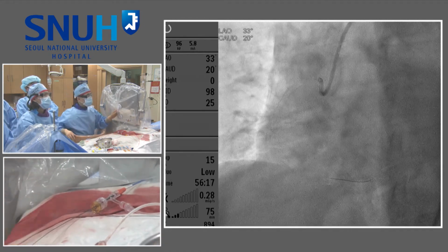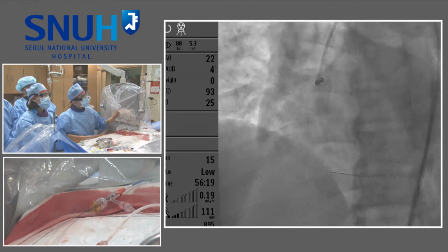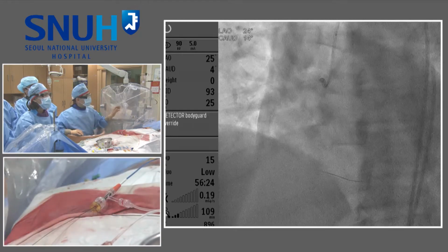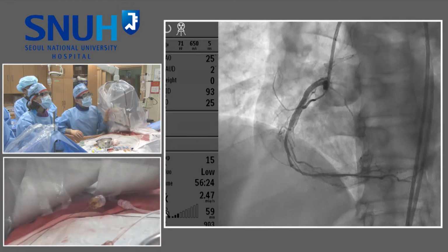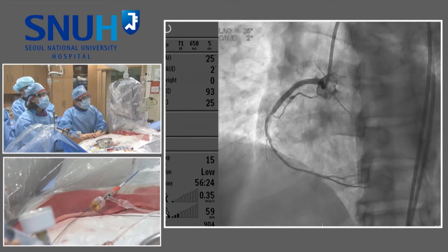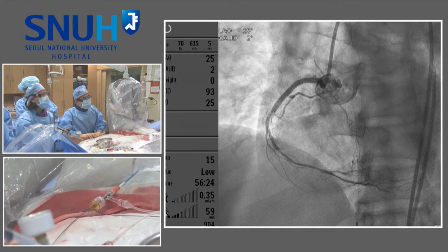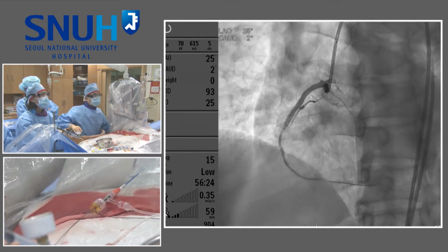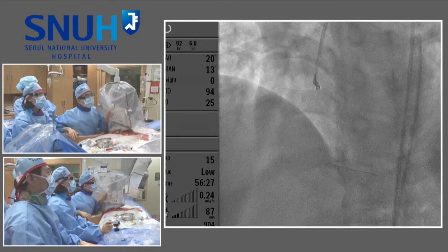자, 쓰는 준비. 자, 크라니아 조금 줘볼까요? 스탑. 오케이, 스탑. 방향 안 좋은데. 카메라에 쓰네. Then I'd like to deploy about a 2.75 stent. Where? Distally. Cranial, cranial. Stop. 쓰네.